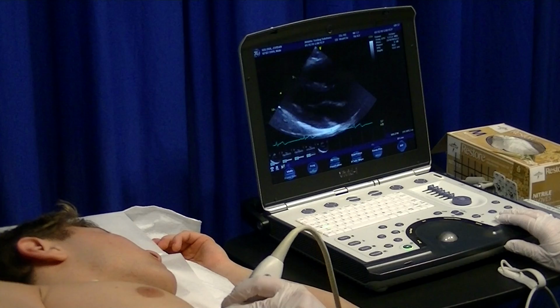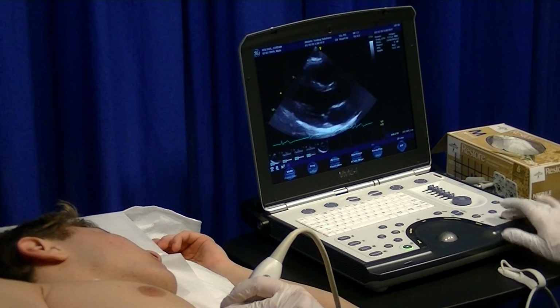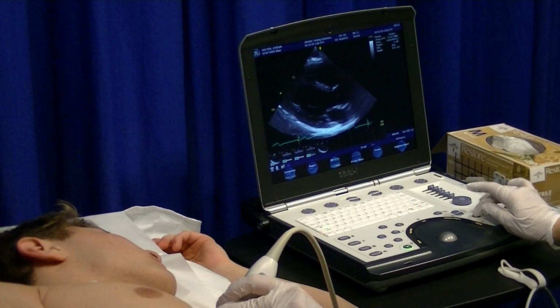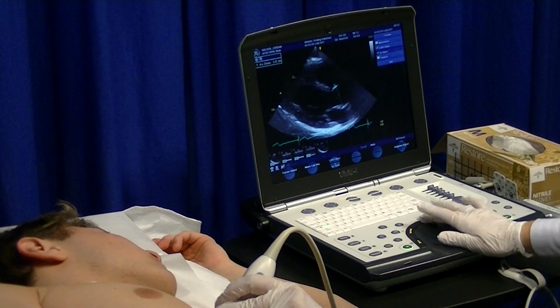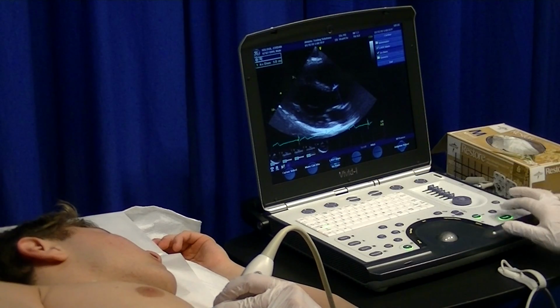If you do detect some aortic dilatation at this point, it would be good to go ahead and do a 4-point aortic measurement if you're able to obtain it, or at least provide a clip of the ascending aorta. So we're going to go leading to leading.